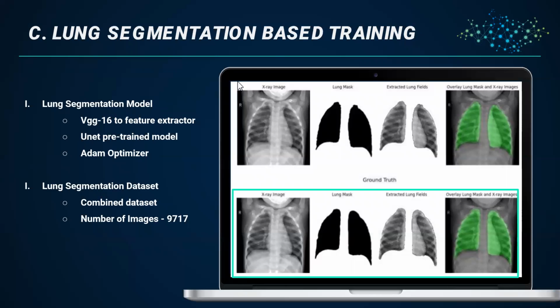In order to segment lung areas of chest X-ray images, we used a UNet model, whose encoder part was the feature extractor of the VGG16 architecture. During training, Dice coefficient was used as a loss function. The model takes a three-channel image of size 448 by 448 and outputs an image of the same size.